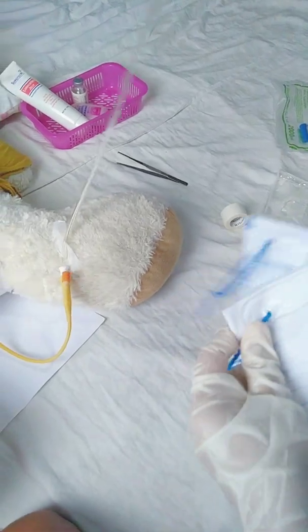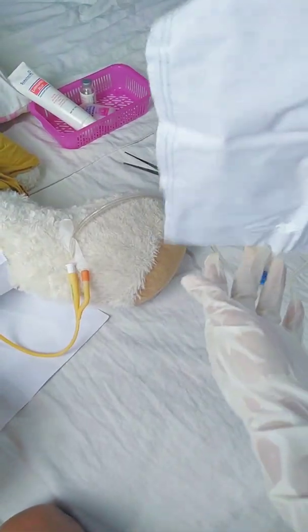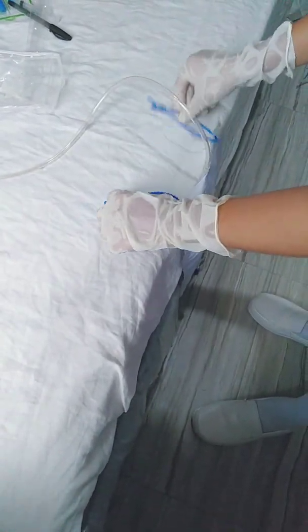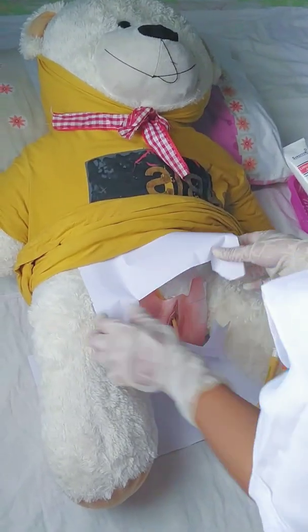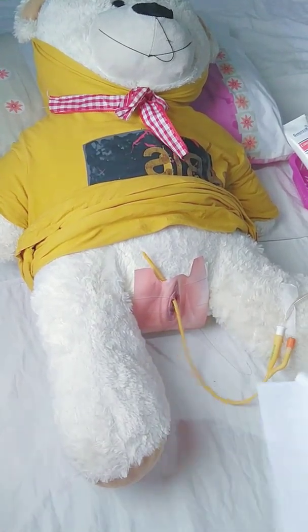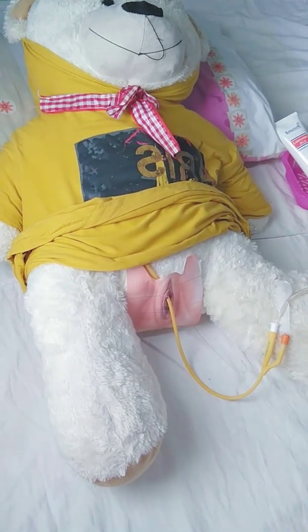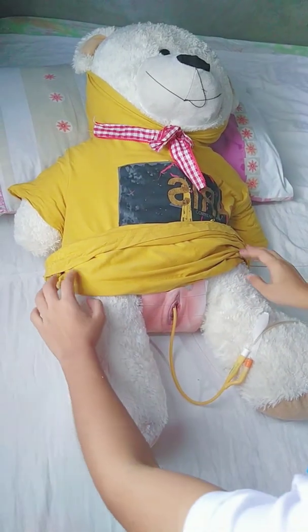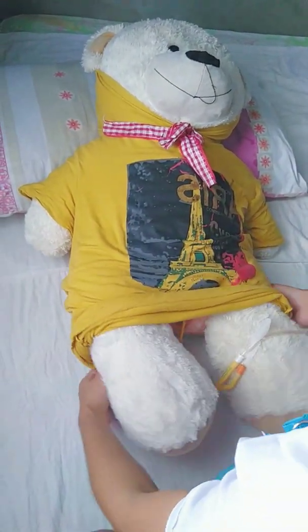Make sure the tubing is not kinked, and secure the drainage bag to the bed frame below bladder level, but do not let it rest on the floor. Dispose of the used supplies and then remove the gloves. Assist the patient to a comfortable position. So, Mom, are you okay?